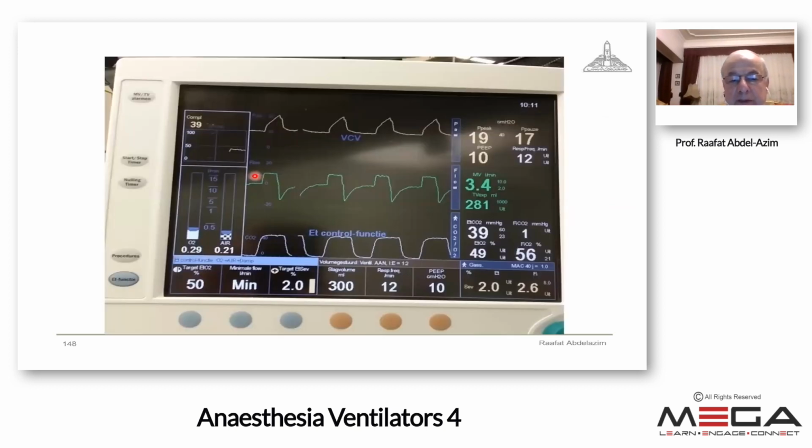This is the actual display showing volume controlled ventilation. This is the airway pressure changes, and this is the flow scalar. And here in flow, we can see that the flow is constant or square form. So this is for volume control ventilation.